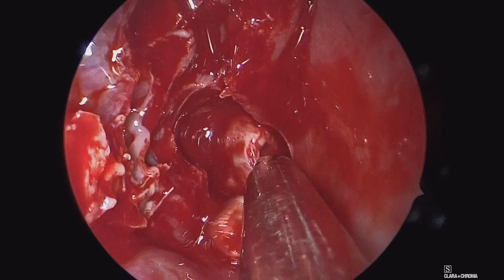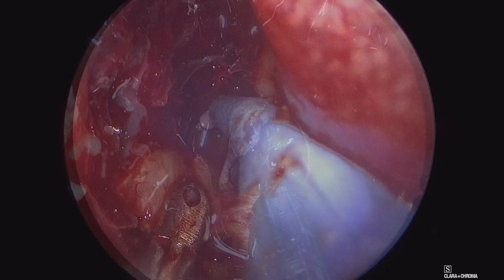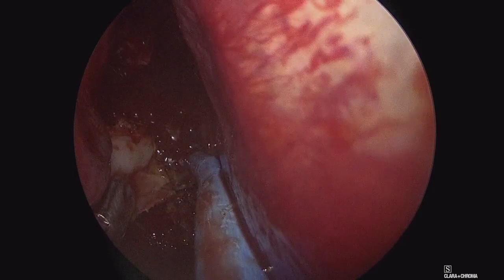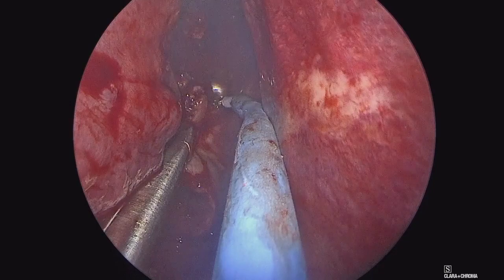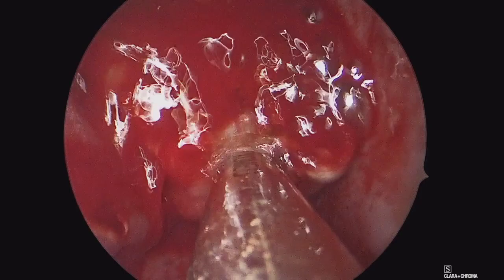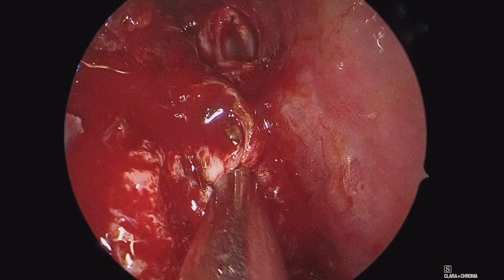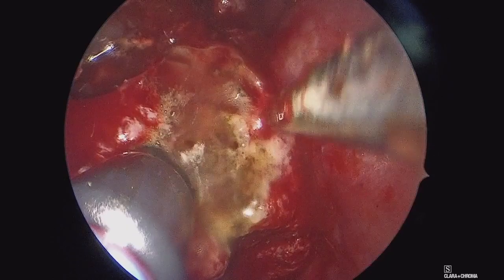Here we are working above the tumor, doing some of our more posterior sinus work to facilitate instrumentation and access, then beginning to debulk the tumor as it hangs in the nasal cavity. As with most sinonasal tumors, we do this by a debulking technique where the tumor is not attached, removing the bulk within the nasal cavity and allowing egressive blood towards the nasopharynx, which is really important for vascular tumors to improve visualization. Here we are with a microdebrider trimming the most inferior aspect of the tumor. These have a very firm fibrous stroma and sometimes the microdebrider is not quite effective enough; you may need through-cutting instrumentation. In this case, the microdebrider was able to remove it in a piecemeal fashion.